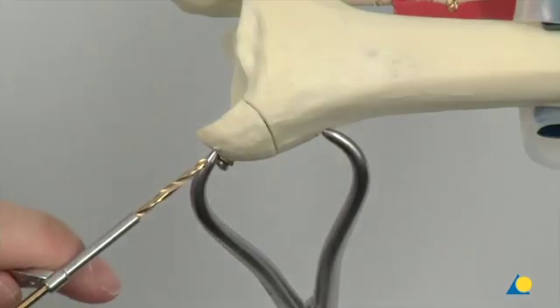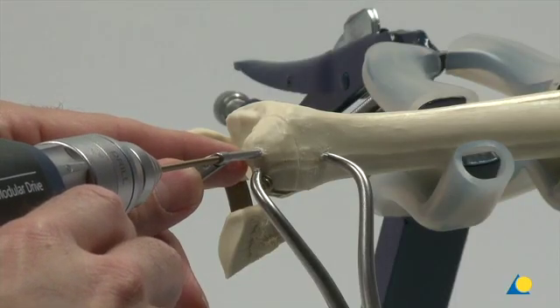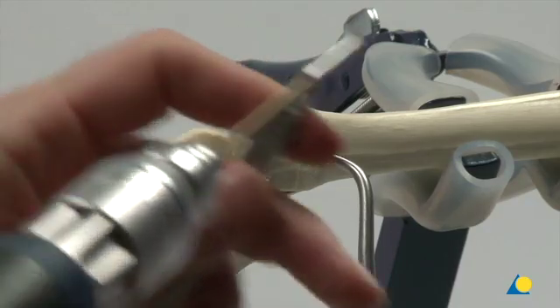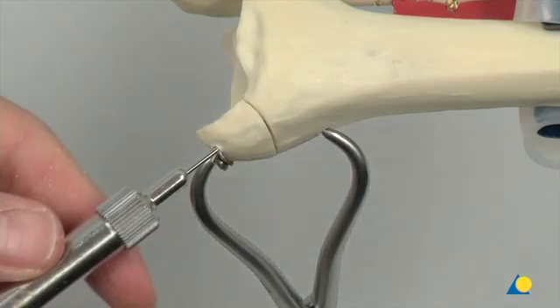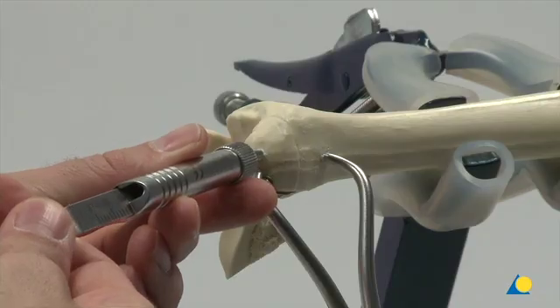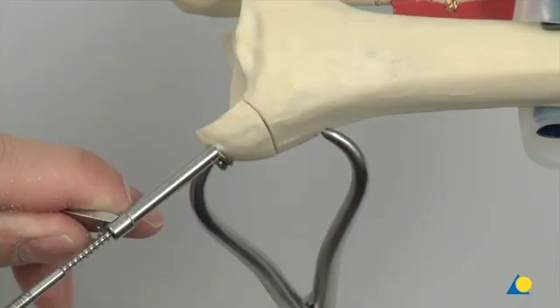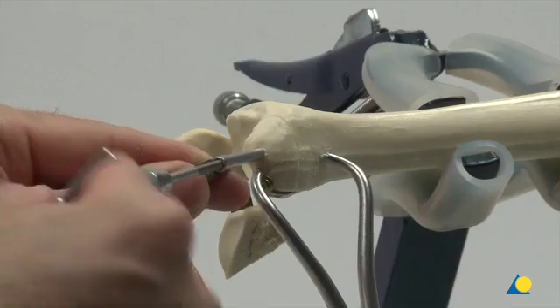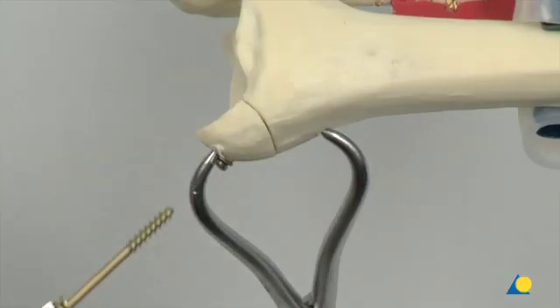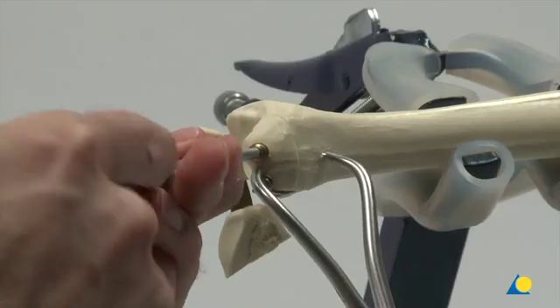The hole for the second screw is drilled with the 2.5 mm drill bit in the same position as the channel of the previously removed K-wire. The required length of the screw is measured with the depth gauge. The 4.0 mm cancellous tap with appropriate sleeve is used to create the threads, and the second 4.0 mm cancellous screw is inserted in the same manner as the first one.